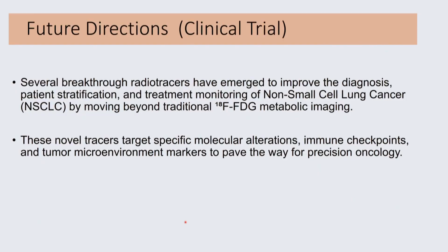Several breakthrough radiotracers have emerged to improve the diagnosis, patient stratification and treatment monitoring of non-small cell lung cancer by moving beyond traditional FDG metabolic imaging. These novel tracers target specific molecular alterations, immune checkpoints, and tumor microenvironment markers to pave the way for precision oncology.